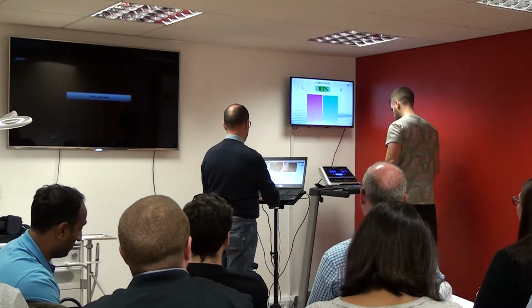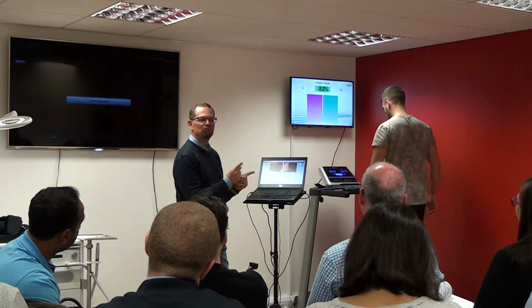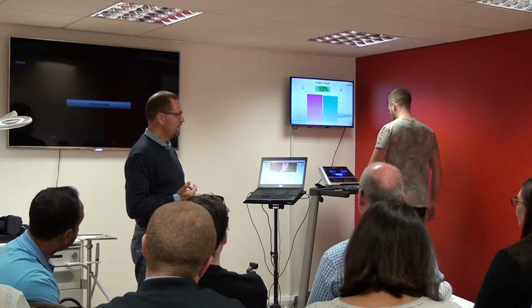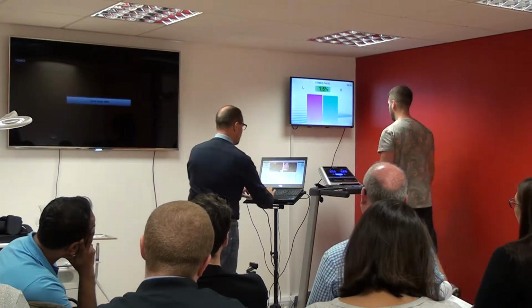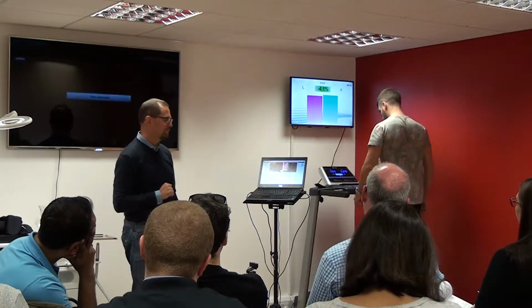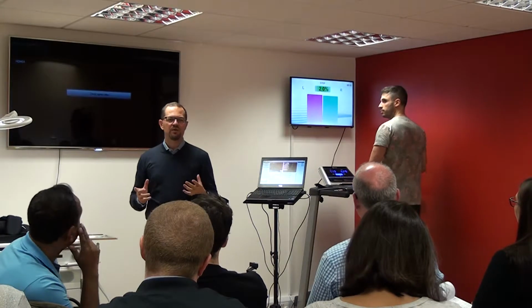Say his was the review of the step length. Does he have the ability to do that or not? Yeah. And in the meanwhile, we can have a look at what's going on up there, okay? Or we can choose step. Okay. Right. So we can use it as a training tool.